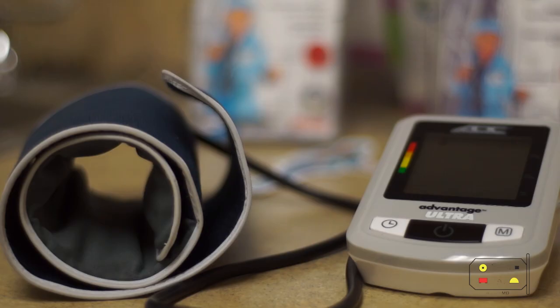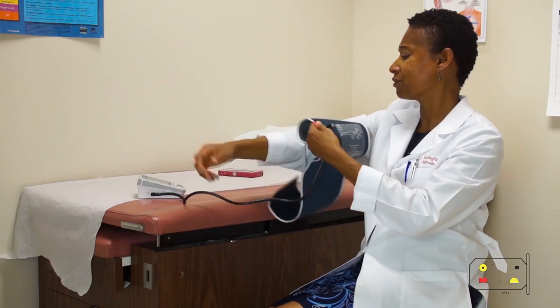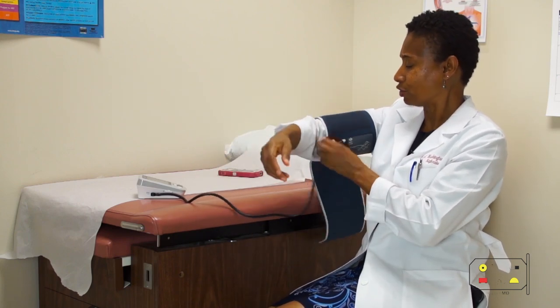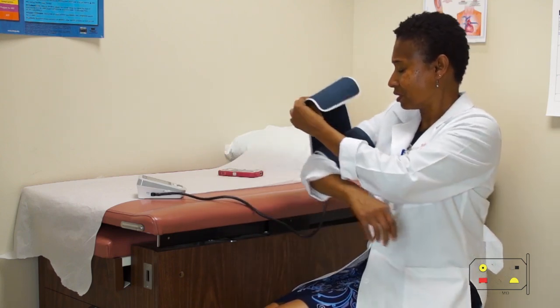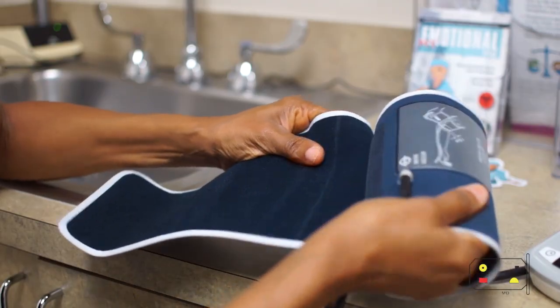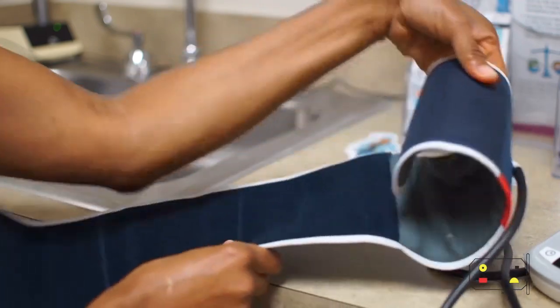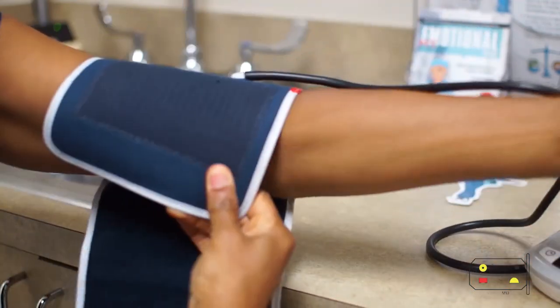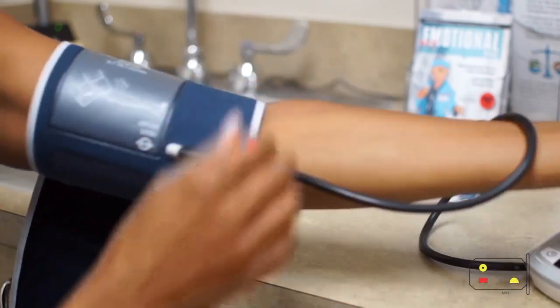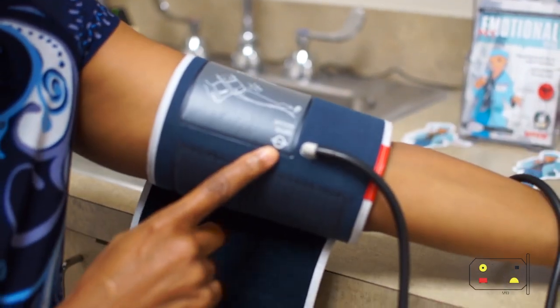And these digital blood pressure monitors are very easy. Now, ideally, you would not be taking it with all of this clothes on. I have on my lab coat, unfortunately. But you take this, the bare arm, before I close it up. It has an indicator of where your artery is, where you're supposed to line this up at. You'll find your artery. Take your blood pressure the same time every day, because your blood pressure varies throughout the day.